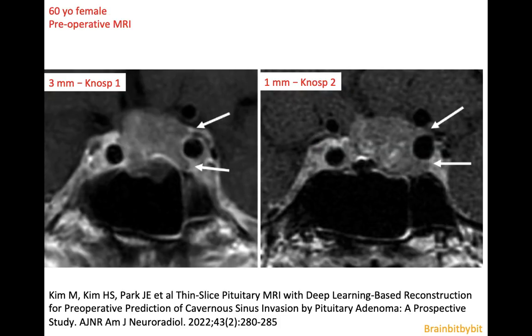To evaluate the cavernous sinus it's best to use one-millimeter images. Comparing the same patient — a 60-year-old female — on three-millimeter versus one-millimeter images at the same level, on the three-millimeter images you would say the extension is less than 180 degrees surrounding the carotid artery, whereas on the one-millimeter images you would say it's between 180 and 270 degrees.